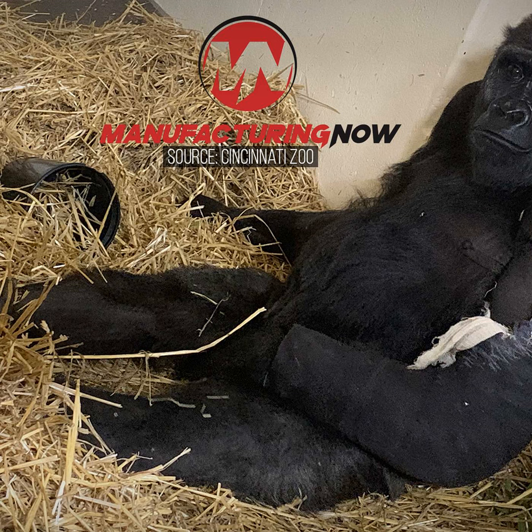A broken arm is an uncommon injury for gorillas in captivity, so the zoo turned to surgeons from Cincinnati Children's and anesthesiologists from the University of Cincinnati College of Medicine for help with repairing the fracture and setting the arm. Knowing the temporary cast wouldn't last long, the zoo asked GE Additive for help constructing something more indestructible. GE Additive was able to design, print, and iterate a custom titanium cast for the young gorilla and have the whole project done in a fairly short amount of time.